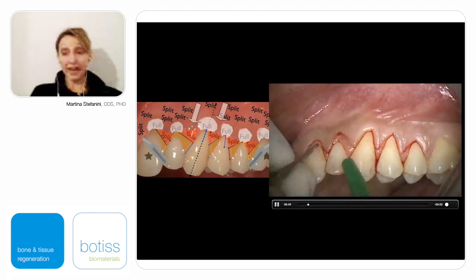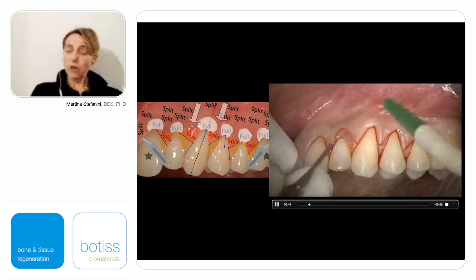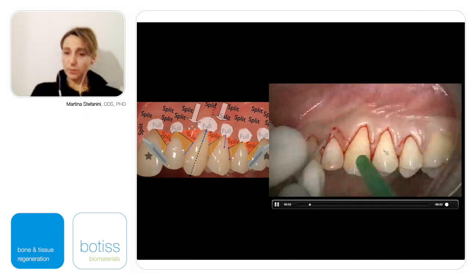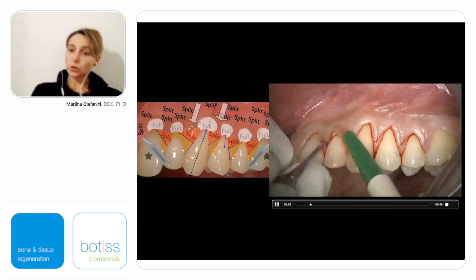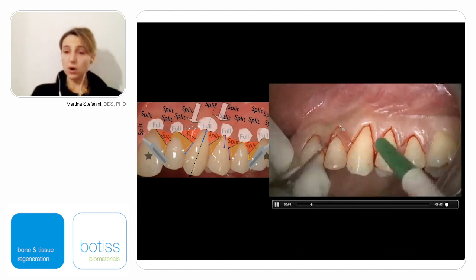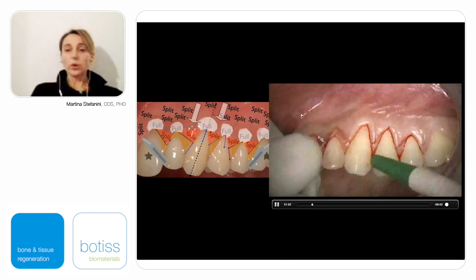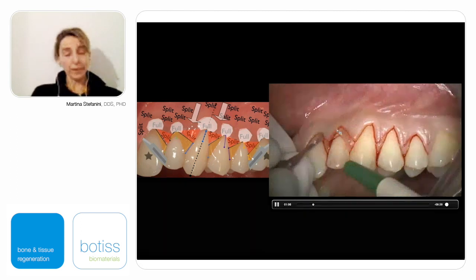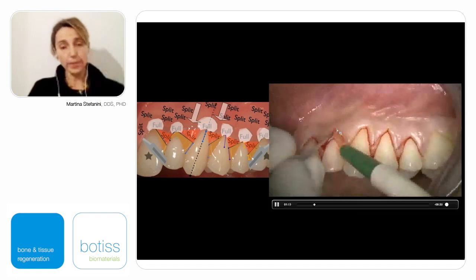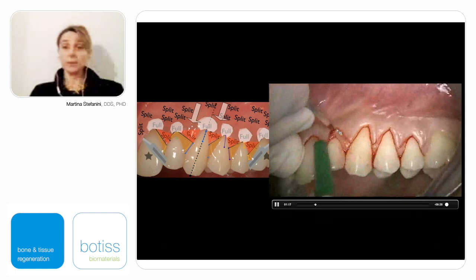And as you can see, the other incisions are performed from the gingival margin of the premolar toward the canine, from the gingival margin of the second premolar toward the first premolar, and from the central incisor toward the lateral incisor, creating this triangular shape papilla in this case, not trapezoidal shape as we performed in the other case, that should be elevated split thickness.